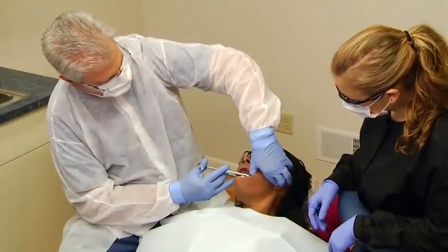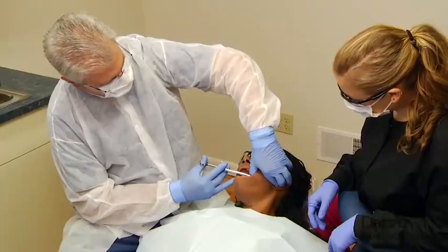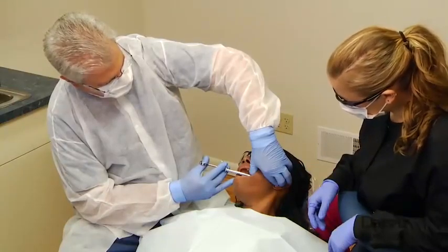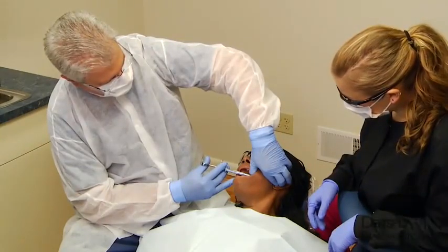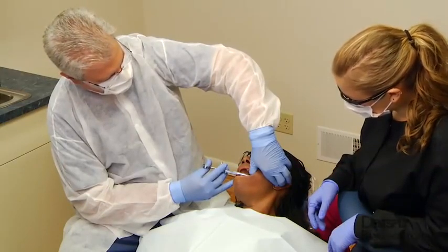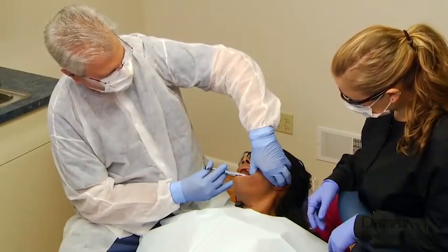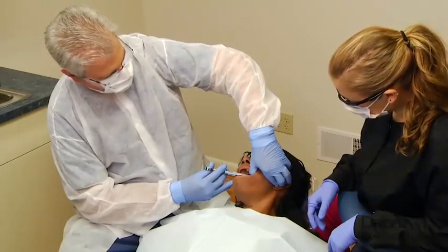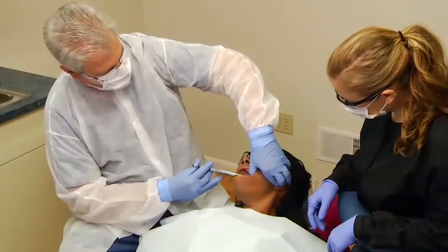When the needle impinges on the condylar neck, it is felt as a solid stop, in contrast to a glancing contact. Once the target is reached, the needle is backed off the condylar neck 1 or 2 millimeters, aspiration is performed, and the entire content of the cartridge is injected over a 1-minute period. The patient is then cautioned to keep the mouth open for 30 seconds after the needle is withdrawn. This maneuver is thought to help spread the anesthetic solution and minimize the distance from the injection site to the nerves of interest. Typically, anesthesia occurs within 5 minutes after injection.